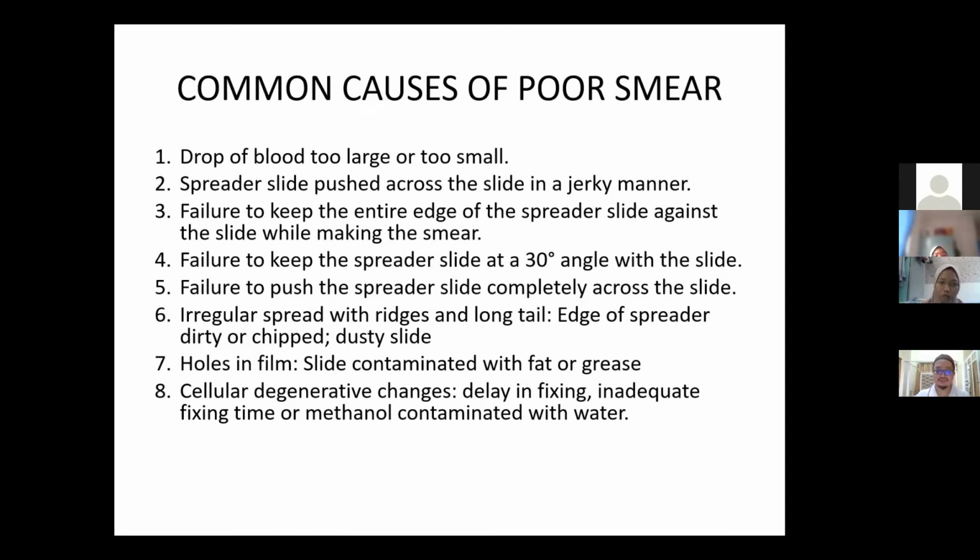on the smear. Setengah orang dia spreader slide tu dia tak duduk betul-betul atas tu. Dia sebab dia tak confident lah mainly. So dia ada separuh terjongkit sikit sebelah. And then when they push the smear, dia ada sebelah je nampak, sebelah lagi tak ada. Okay. Do not smile because you may be the one doing that.